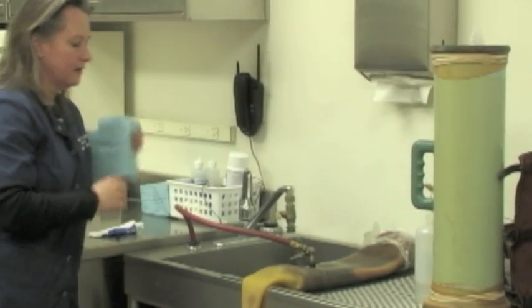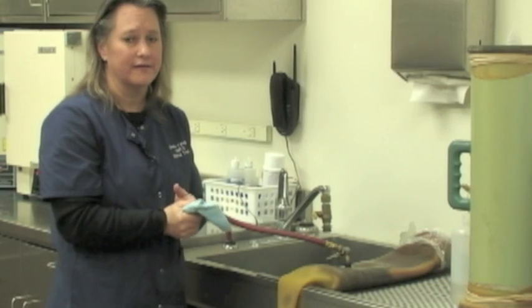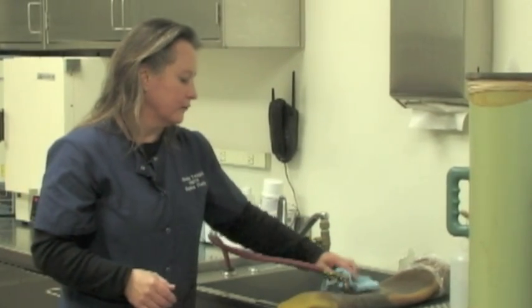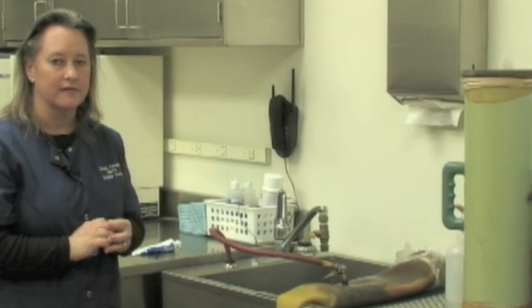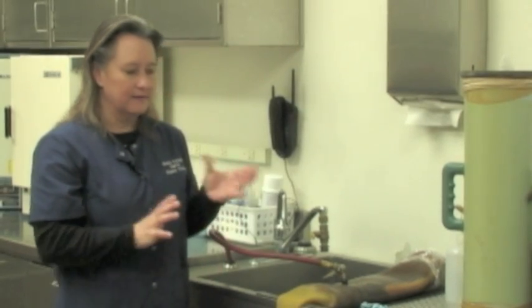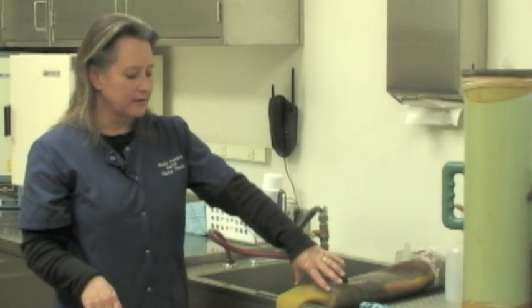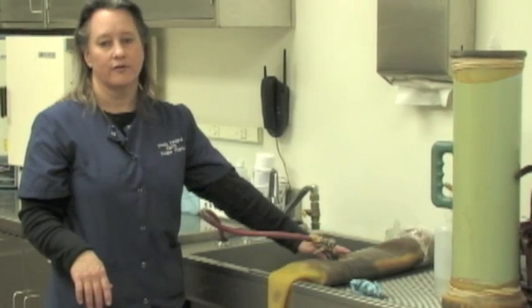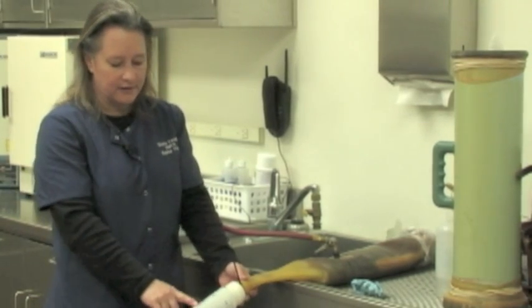The water temperature is very important. Our water comes out of our faucet at 55 degrees Celsius, which is about 140 degrees Fahrenheit, so it's very warm. It's going into a cold AV, so that's going to warm up the AV as well as provide some warmth for the stallion. We would like the ending temperature to be around 45 degrees Celsius, very similar to what the body temperature of a stallion would be. This AV is allowed to overfill with water and then adjusted to the size of the stallion so he can penetrate all the way down to the bottom. In the Missouri model AVs, the stallions actually ejaculate in the bottom portion, which is not surrounded by water, so the water temperature in the jacket can be hotter for the stallion without affecting sperm quality, and the ejaculate drains down into the collection bottle.